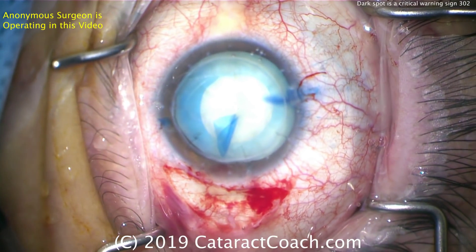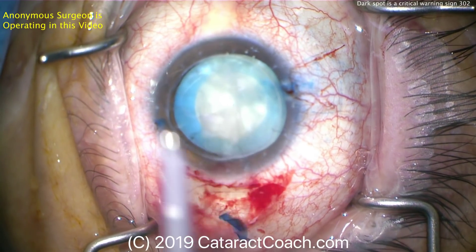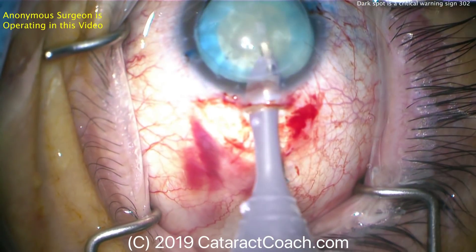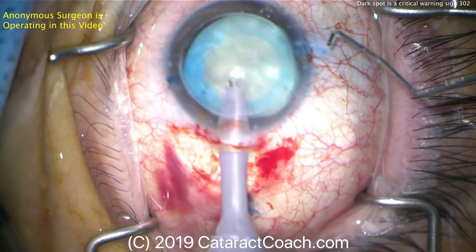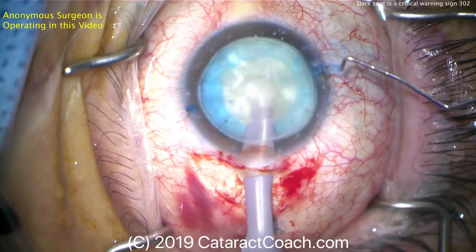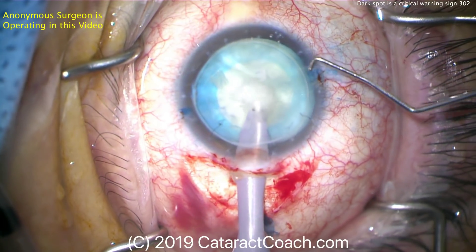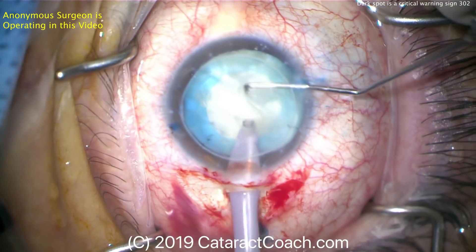We see that the anterior capsule has been stained with trypan blue dye. A round capsulorrhexis has been completed. This is pretty much a white cataract, probably relatively soft. You can see the patient's eyelashes are all black — this is a younger patient. I like the scleral tunnel; it avoids what looks like a prior penetrating keratoplasty or PKP. The phaco probe is going here probably with the left hand and then the right hand looks like the chopper instrument — a Nagahara-style chopper — so perhaps a left-handed surgeon.